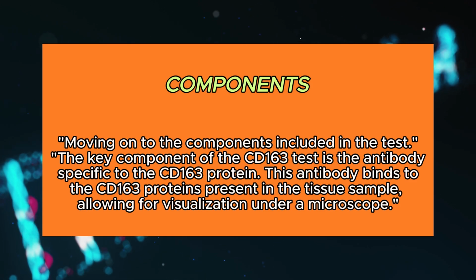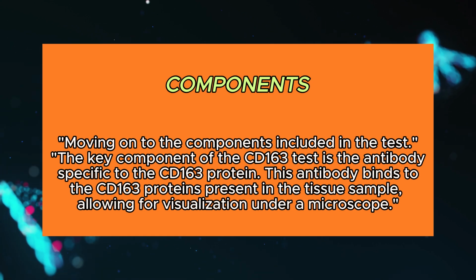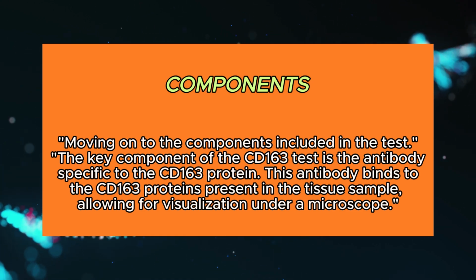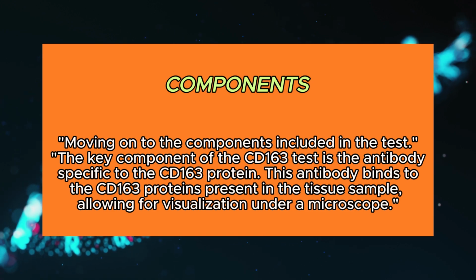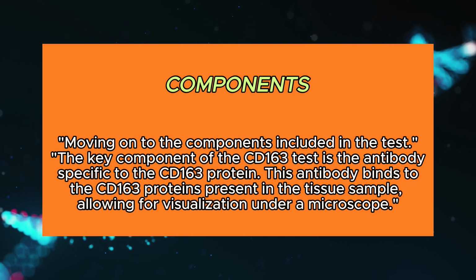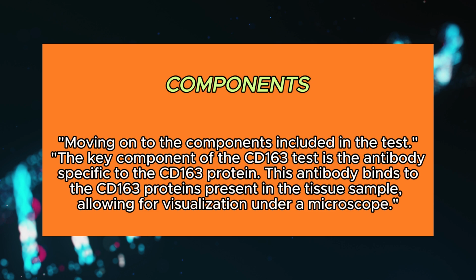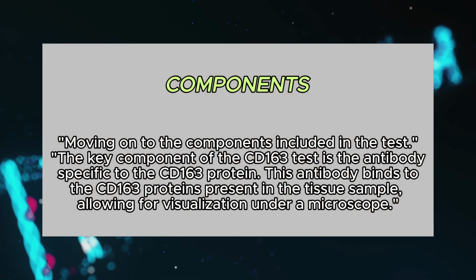Components included. Moving on to the components included in the test. The key component of the CD163 test is the antibody specific to the CD163 protein. This antibody binds to the CD163 proteins present in the tissue sample, allowing for visualization under a microscope.